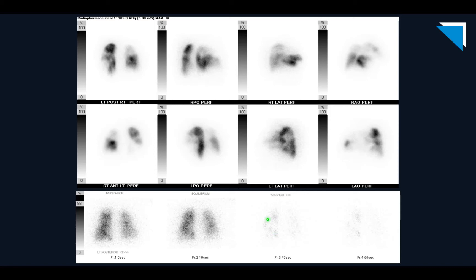Comparing the posterior projection of the perfusion study with the ventilation study, there are numerous defects in perfusion of the left lower lobe base, large defects at the right lower lobe base, the right lower lobe superior segment, and the right upper lobe apex. Looking at all of the other perfusion projections, you see numerous large and moderate peripheral segmental defects. This examination would be read as high probability using the PIOPED 2 or modified PIOPED 2 criteria. Using a trinary system, you would call this PE present.